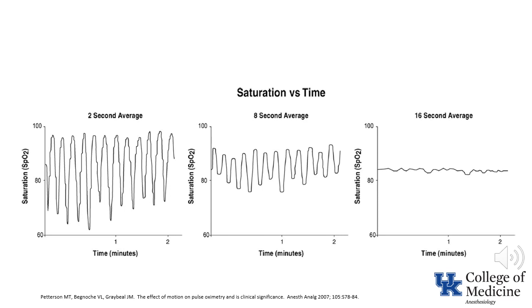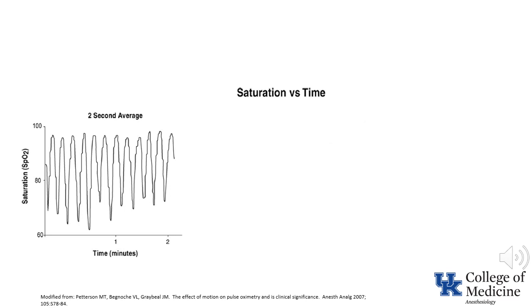This slide looks at the impact of data averaging on detecting apnea in premature infants based on pulse oximetry. The first panel shows frequent episodes of desaturation associated with apnea when the data are averaged over 2 seconds. Clinically, it's evident that all the episodes are rapidly detected.